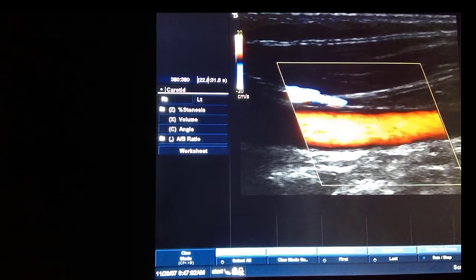And that is kind of it for chapter 20, everybody. So I cannot encourage you enough to get out, get on a machine, practice some of these physics concepts. They'll make more sense the more that you use them. They will become almost ingrained in your muscles. When you see that you're aliasing, you'll just know exactly, oh, I need to change my PRF. Oh, I need to change to this. I need to look at my baseline. The more you see that artifact, the more you see the wrong imaging technique being used, the quicker you are going to be able to recognize how to change it.